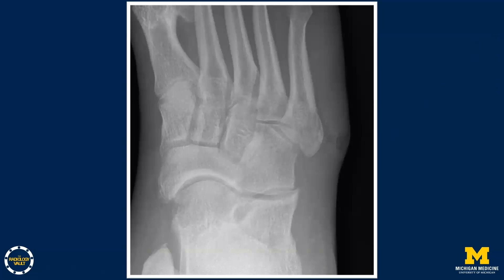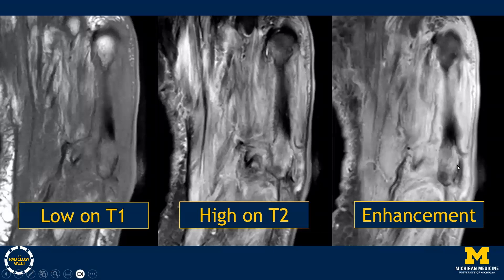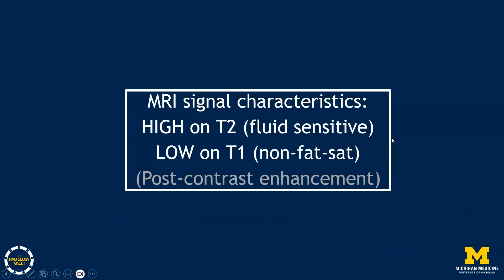The next step to confirm osteomyelitis is MRI. On MRI of the same patient's foot, axial images focusing on the lateral midfoot show soft tissue ulceration with underlying low-signal foci of gas and a non-enhancing tract on post-contrast images. In the adjacent fifth metatarsal base, there are marrow signal changes: low signal on T1-weighted images, high signal on T2-weighted images, and enhancement on post-contrast images — consistent with osteomyelitis. Post-contrast enhancement is helpful but not totally necessary to make the diagnosis.